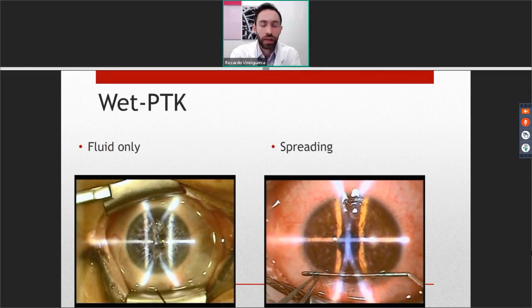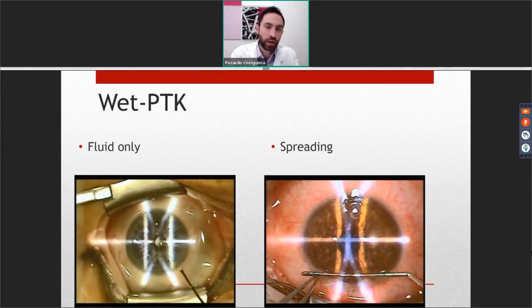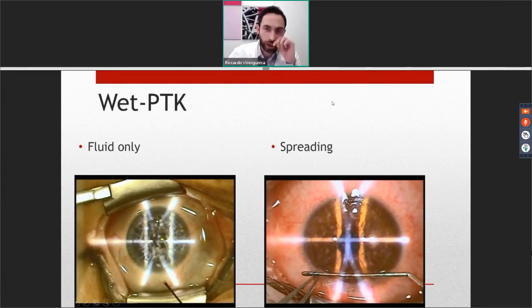And this is something that we have done for years before the smart surface. But obviously, in a patient that is irregular, the smart surface technology is not enough. So I'm going to show you how it works in real life. So this is a patient.